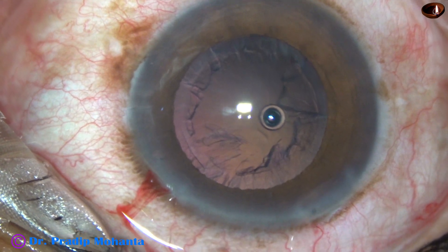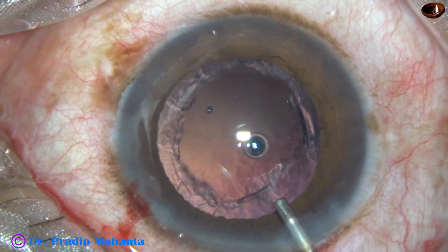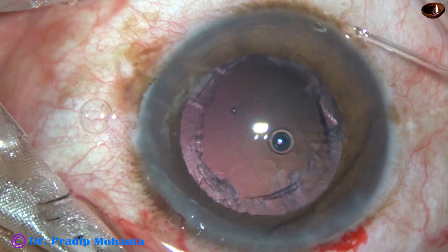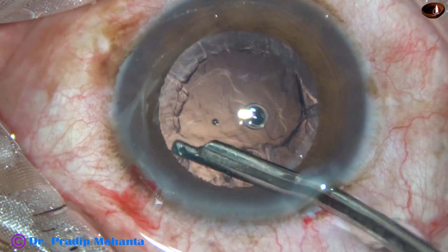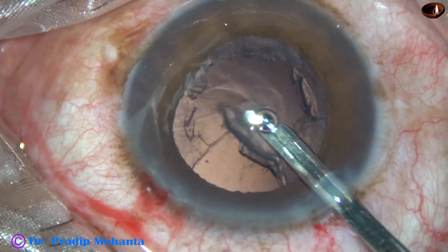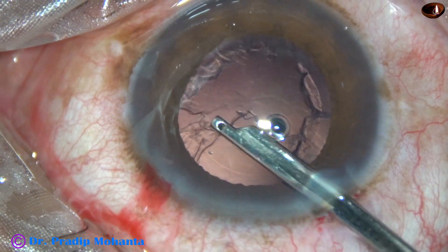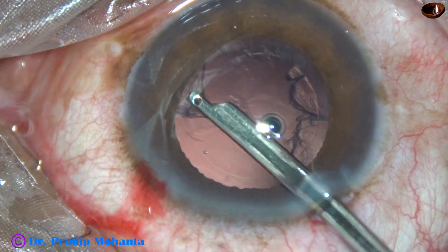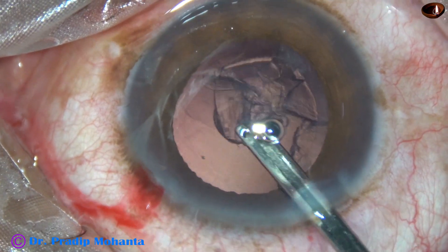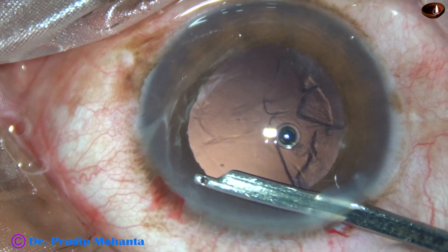In this case I have made only one side port, and I'm going to use a 23G Simcoe cannula for removal of the cortical lens matter. The epinucleus from the left side is being removed, and now the epinucleus from six o'clock to nine o'clock is also being removed.